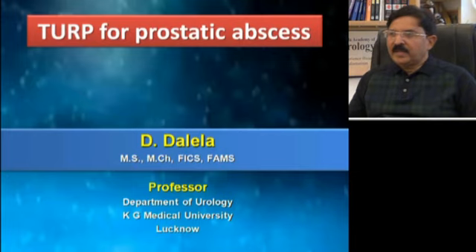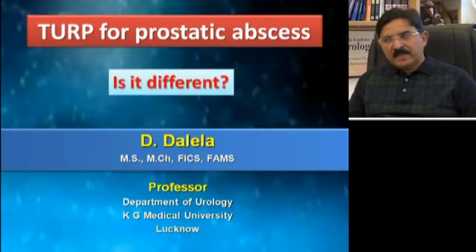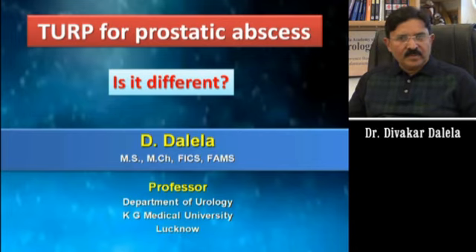In this video I shall share with you some important points when you have to perform the transurethral resection of the prostate and the patient is having a prostatic abscess. You may call that TURP for prostatic abscess. I will specifically try and highlight those points where the technique of resection is slightly different from what is standard.